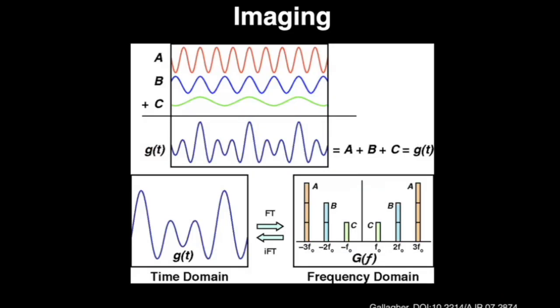So now we can detect this group of frequencies, and it turns out there's a very handy mathematical framework that lets us disentangle these spatially. That's called Fourier analysis, and we leverage it; it's essentially the basis of a lot of MR image reconstruction. We have a signal with frequency information encoded in it, something that looks like that second graph there, which represents sine waves A, B, and C, the red, blue, and green waveforms, added up together.